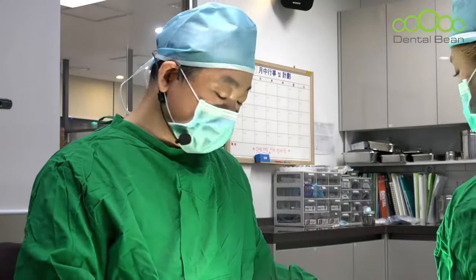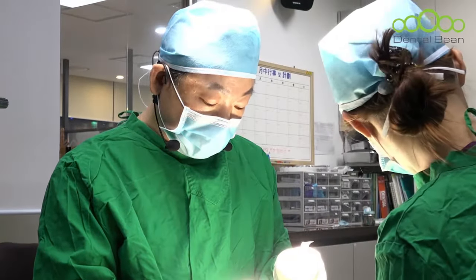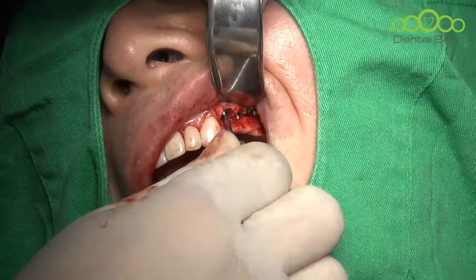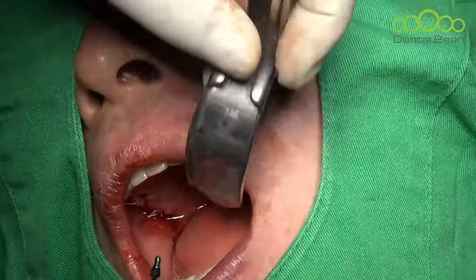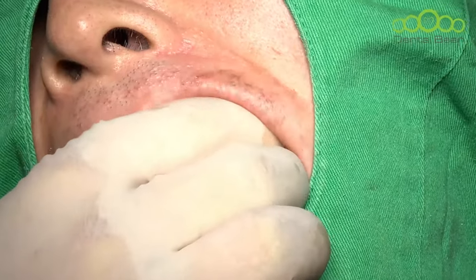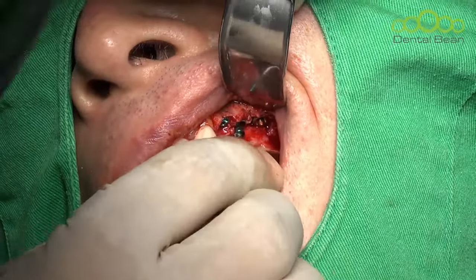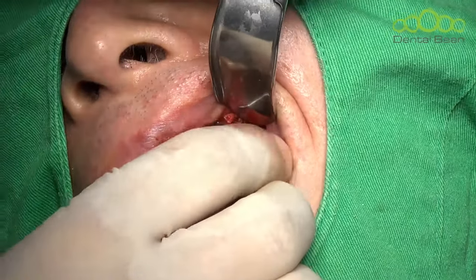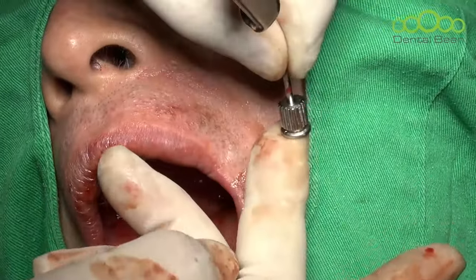Let's connect the cover screws. On the left side, I can control it by myself, no need for assisting. One more. Molar site. I'm supporting the hand driver with my middle finger, so I can prevent the instrument from dropping like this, okay, like this. With the middle finger, I'm supporting the hand driver, okay, like this.